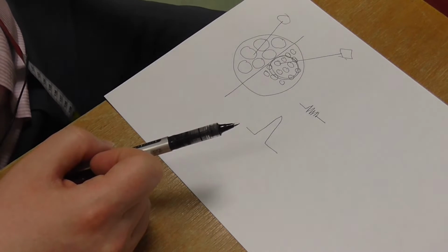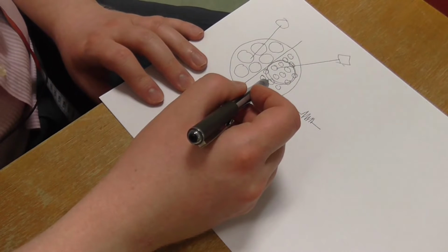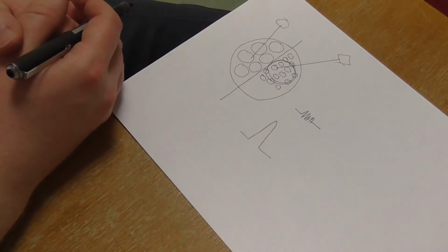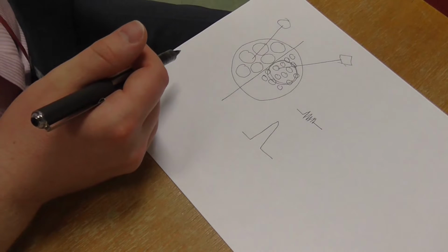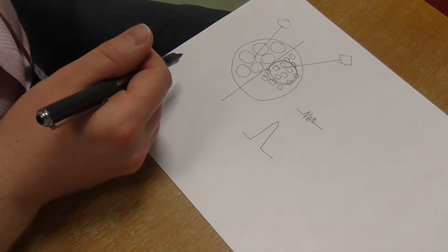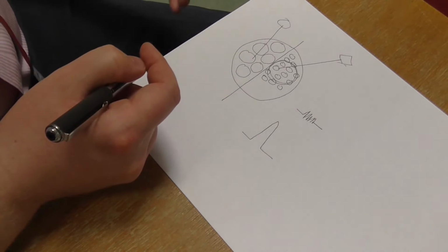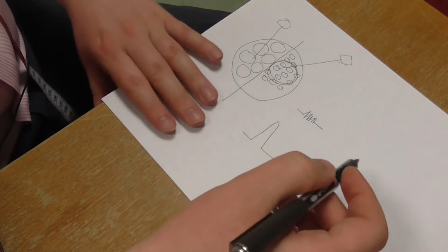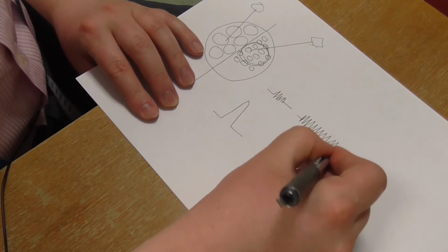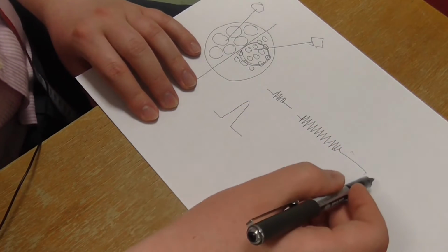Lots of signal driving the muscles to squeeze is going to occur, and so we're going to be driving these small shrunken muscle fibres as hard as possible in order to generate force. Because they're also small and so weak, they're not going to be generating that force, but it's going to be the equivalent of the brain whipping the muscles into a frenzy to try and generate the force necessary to activate the movement. Hence, when we're looking at how the motor units are recruited, they're not recruiting like in the Henneman principle. Rather, very, very rapidly we are going to get lots of activity that just fills up the screen very quickly. And this is called early recruitment, and we're seeing small polyphasic units.